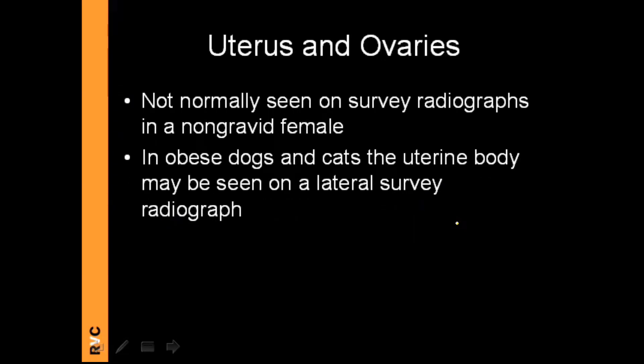The uterus and ovaries are not seen on survey radiographs in a non-gravid female. If the animal is pregnant, we can see the uterus, or if it is abnormally dilated we may even see skeletal structures of fetuses. In obese dogs and cats, the uterus may sometimes be visible on a lateral survey radiograph due to the surrounding fat providing contrast, but that is the exception.